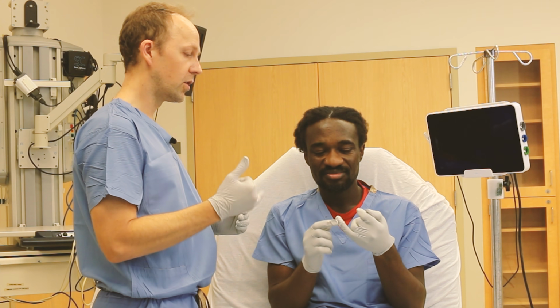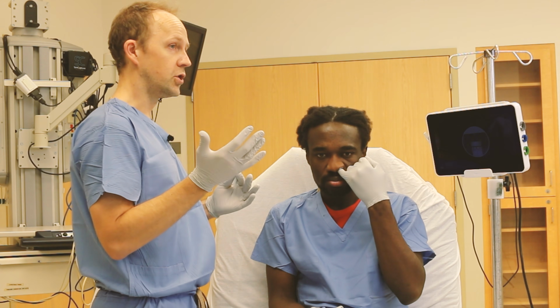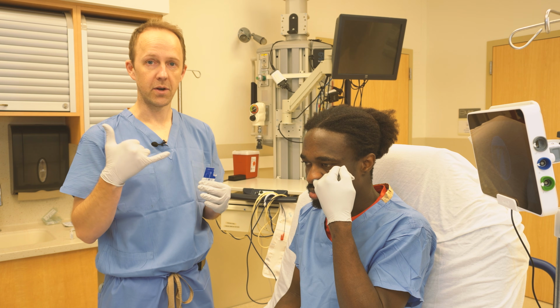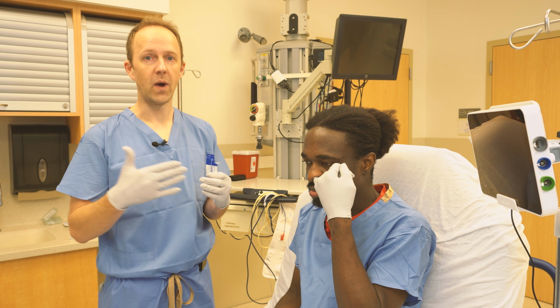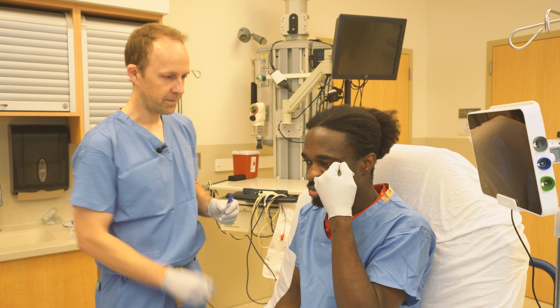And the finger goes in slowly. So the dilation is probably a 2 to 6 or 7 minute procedure as you slowly get deeper and deeper in with that pinky finger. You can sort of feel the nasal mucosa giving way as the finger gets deeper in there.